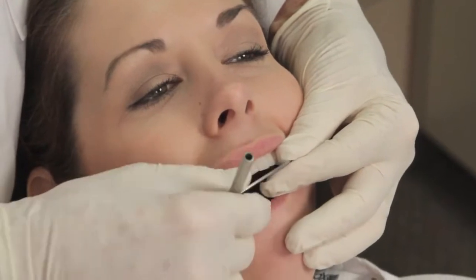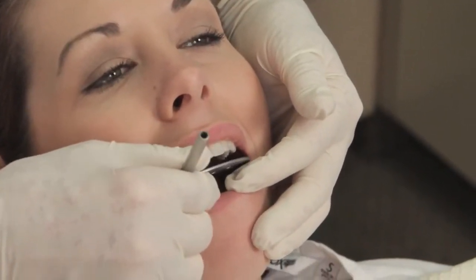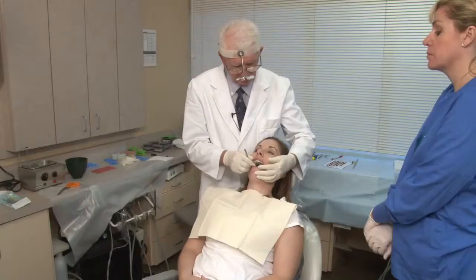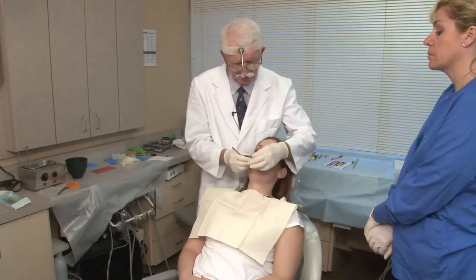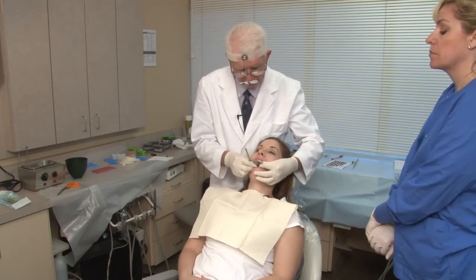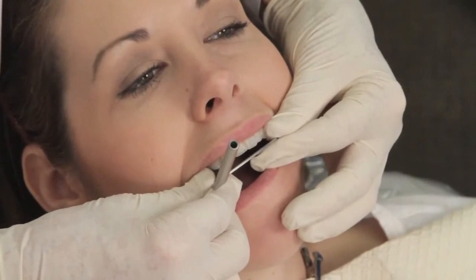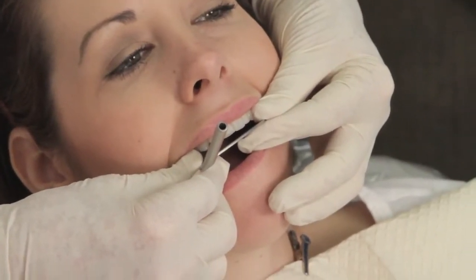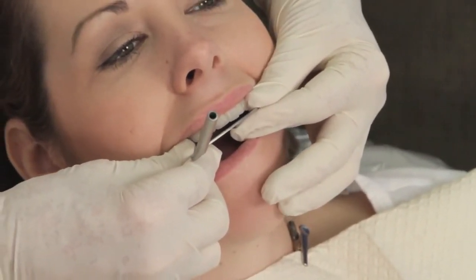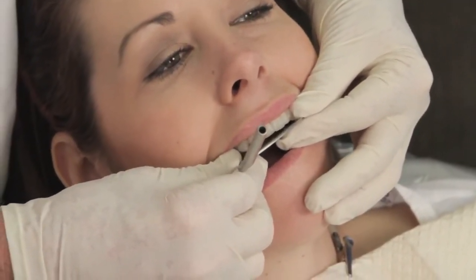I don't like to do it like this, where I don't have any feeling of where the teeth are in relationship to the bite fork. I like to feel the teeth and the bite fork at the same time. So I can put my thumbs on the buccal face of the canines, line up the midline, and then I can seat against the teeth.